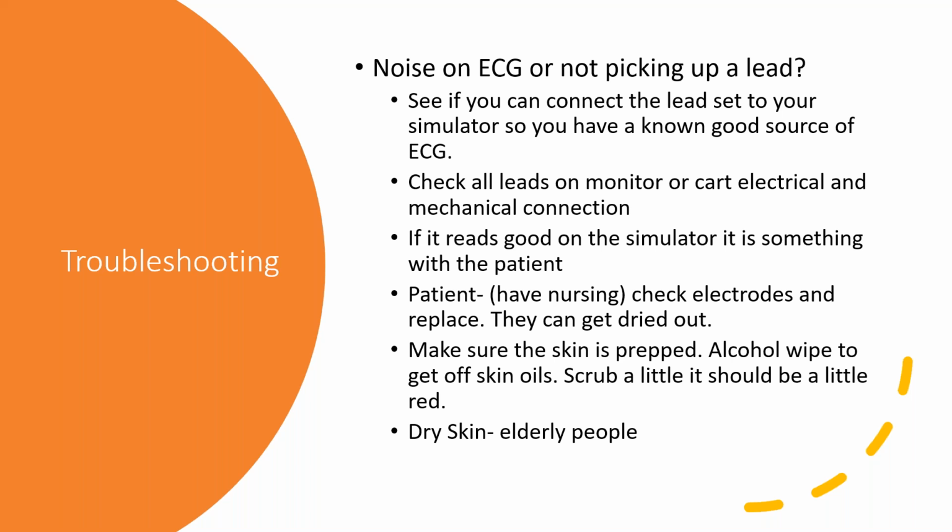It's funny because whenever I go on a troubleshooting call for ECG, I always ask, when's the last time you replaced the electrodes? And the answer is always, oh, we just replaced them not that long ago. Every single time. I don't know how long not that long ago is, but can you change those while I'm here so I can see, and look at the package they're in also, because once they tear that package open, it starts drying out too. Sometimes they dry out in the package. So you might have just replaced them, but with more bad leads that are dried out.